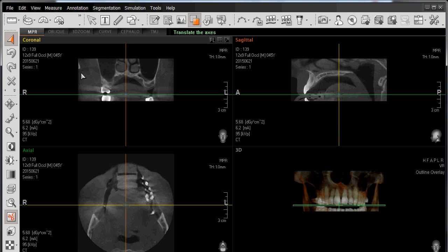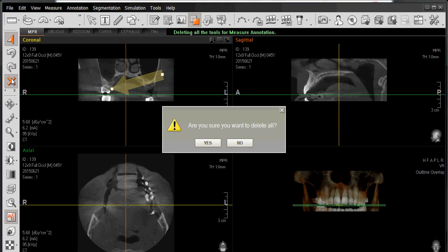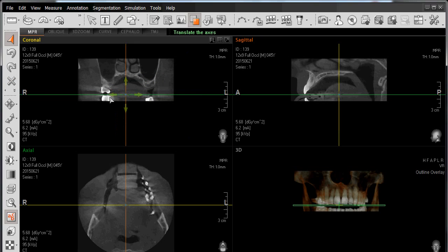And if I wish to delete something, such as perhaps drawing this arrow and deleting that, I left-click on Delete All and respond to the prompt by selecting Yes to remove that arrow.